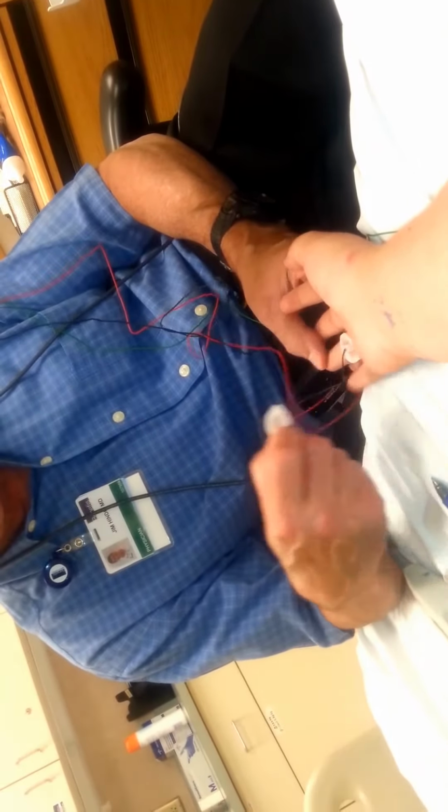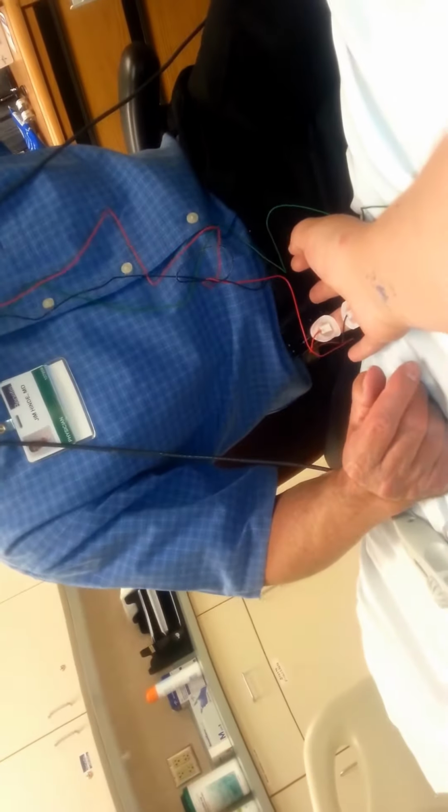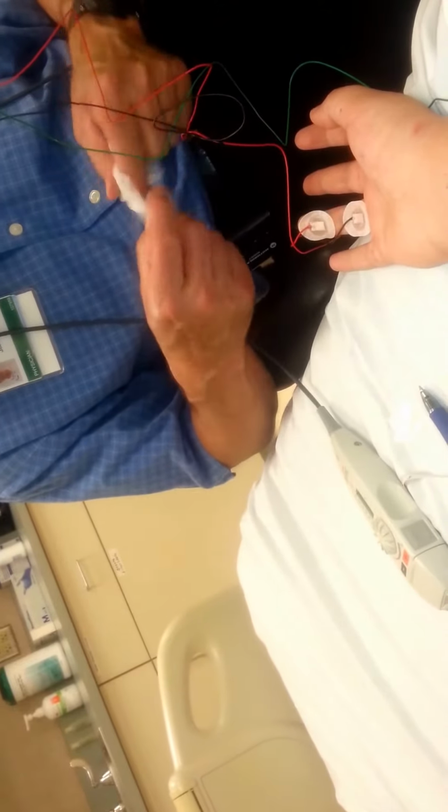So the nerves that give strength to your muscle are fast, both of them. There are 3 different nerves that give feeling to the fingers: the median, the ulnar, and the radial nerve. And so we're going to look at branches of all of those nerves to see if they're slowing.